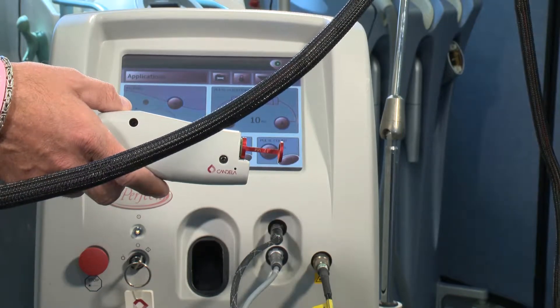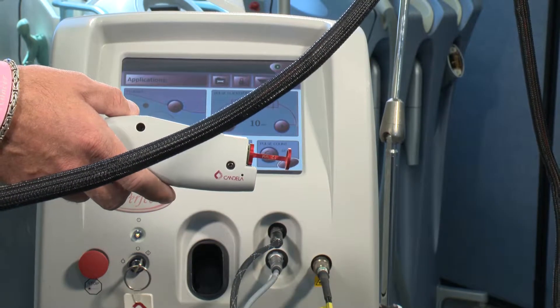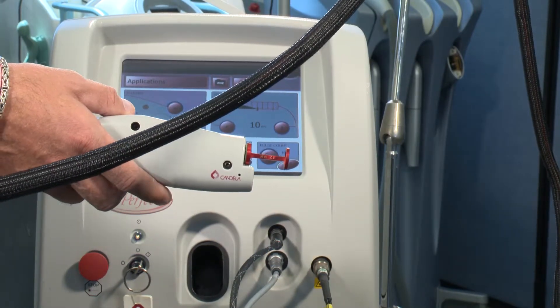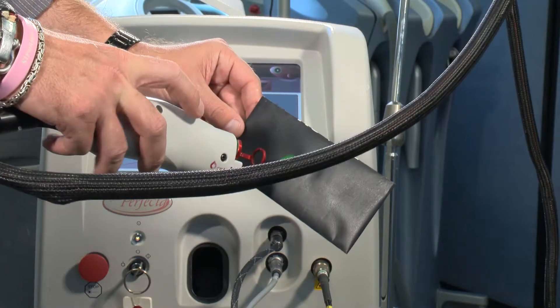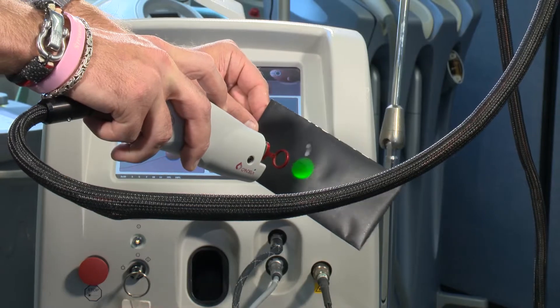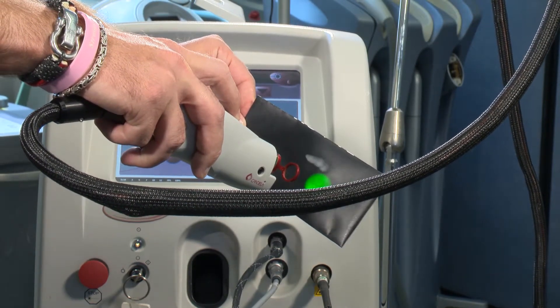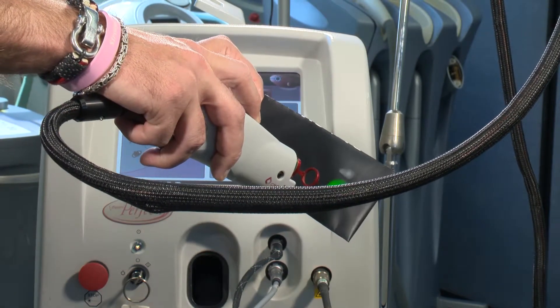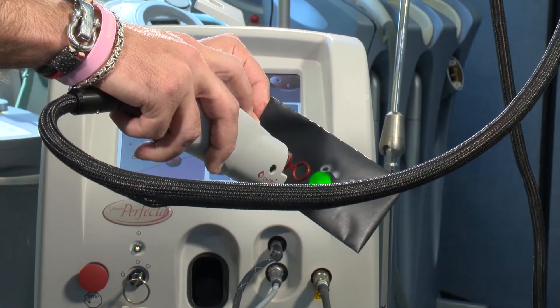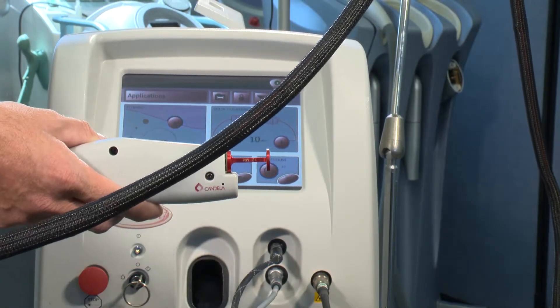Now that everything is calibrated, we'll go ahead and do a test fire on the device. As you can see from the screen, everything's in ready mode. We have our test paper here — and firing. As you can see, it's all in good working condition.